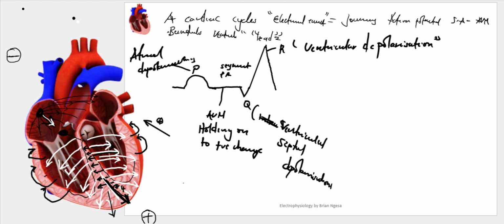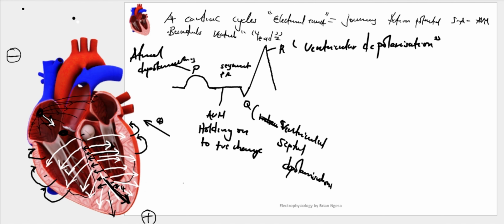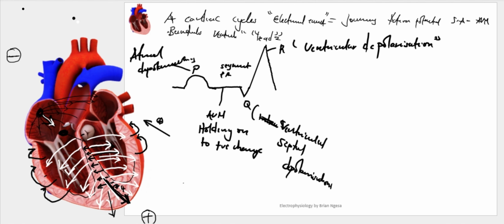We will be having the same story for a lead whose positive is in this. For example, the right augmented, where we have positive here and maybe negative there, we'll have a completely different story. Maybe you could be getting some downward deflections, so you'll be able to jot that out. So this is how it's likely to seem.